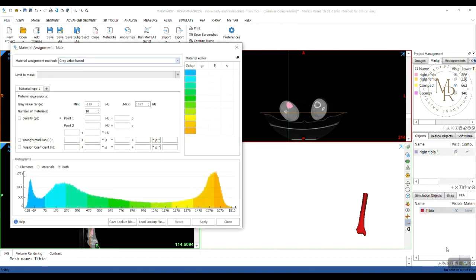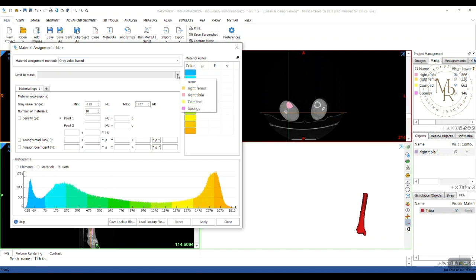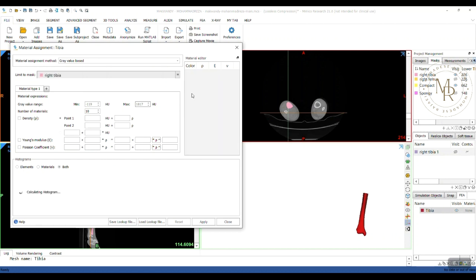From this box, I can assign the materials based on the HU values or grayscale values. To do it more precisely, I limit the material assignment to respective masks that I've generated earlier. Here, write tibia. I will have three types of material: cortical or compact bone, cancellous or spongy bone, and the fat layer in the middle of medullary canal.